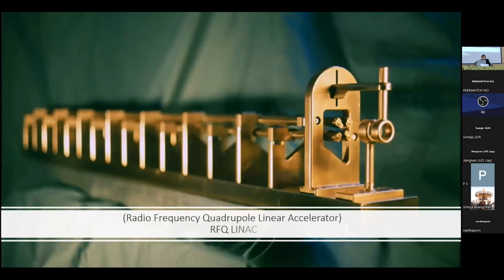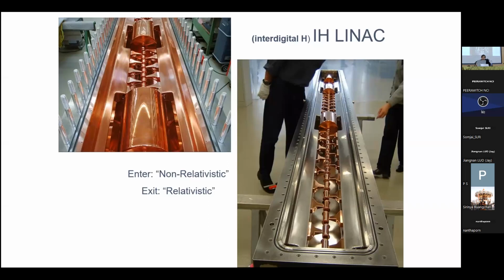This is just a picture of an RFQ. When I said these parts, and I'll go to the next one because it's a little bit prettier of a picture, I say these things are sometimes more expensive than the synchrotron itself because these are very highly machined instruments. With the synchrotron you can tune the magnets, you can tune everything else, but this LINAC has to be machined very precisely because it's very hard to tune it afterwards. So the LINAC, that first component for a synchrotron system, is a key component and actually one of the weakest links if it's not done correctly within the whole therapy unit.